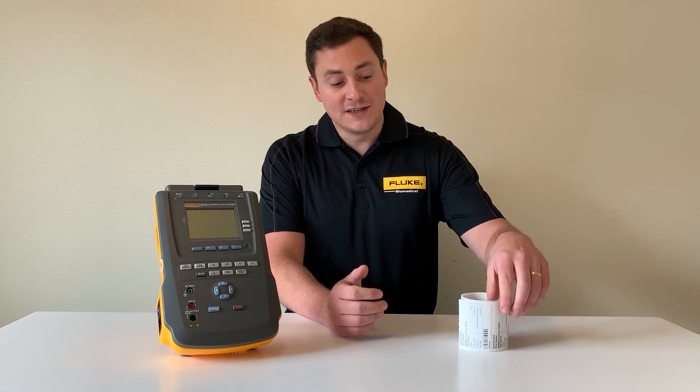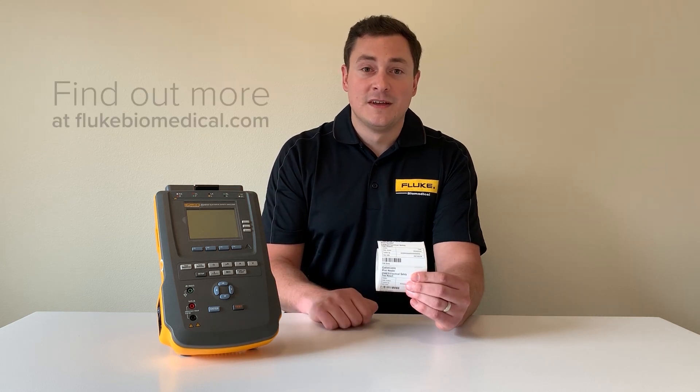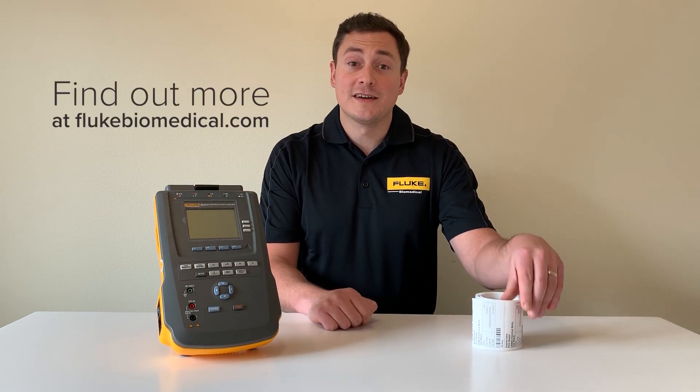Also, if you have a need for printing and you use a PM sticker like this, you can plug in an external printer and print that label right on the spot. To learn more, go to flukebiomedical.com.